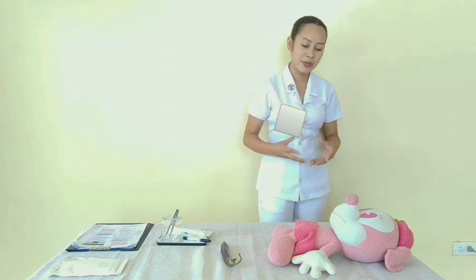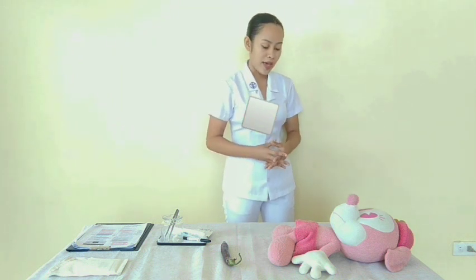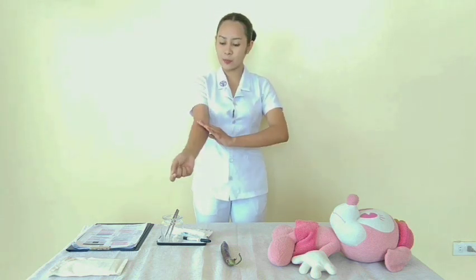Okay, as you can observe, I'm providing you privacy by closing the curtains and the door. Now I'm going to prepare the medication. Now I'm going to select the site to be injected: three to four finger widths above your wrist, below the antecubital space. Then apply clean gloves. Then clean the skin at the site.